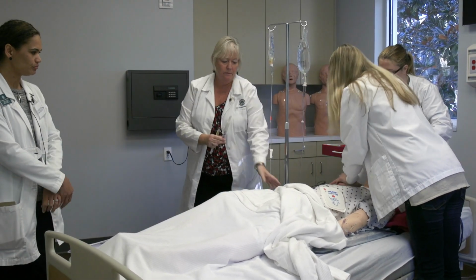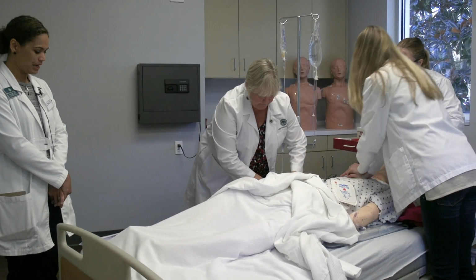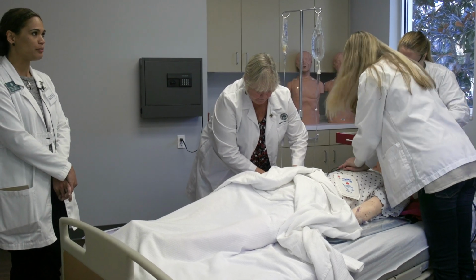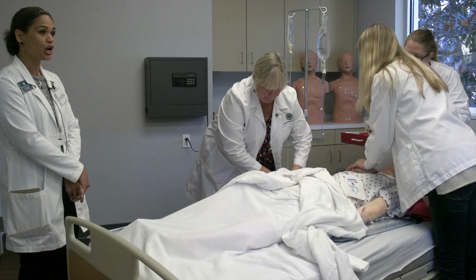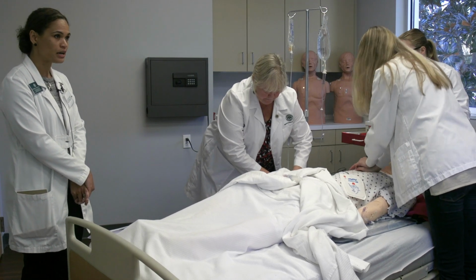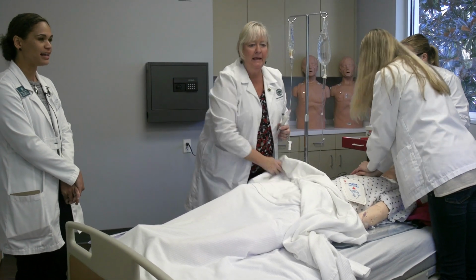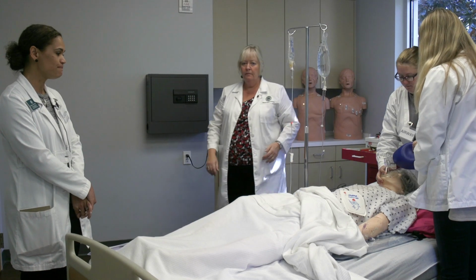Some of the reasons for PEA include hypovolemia, hypothermia, hypoglycemia, hyper- and hypokalemia, as well as hypoxia, cardiac tamponade, tension pneumothorax, toxins, or thrombosis, either cardiac or pulmonary. Epi is in. Thank you. It's likely this patient has hypovolemia.